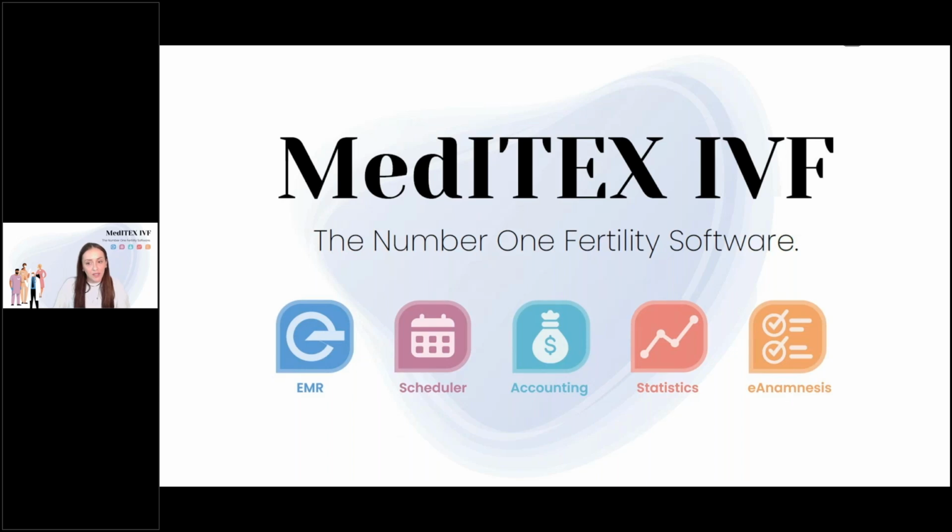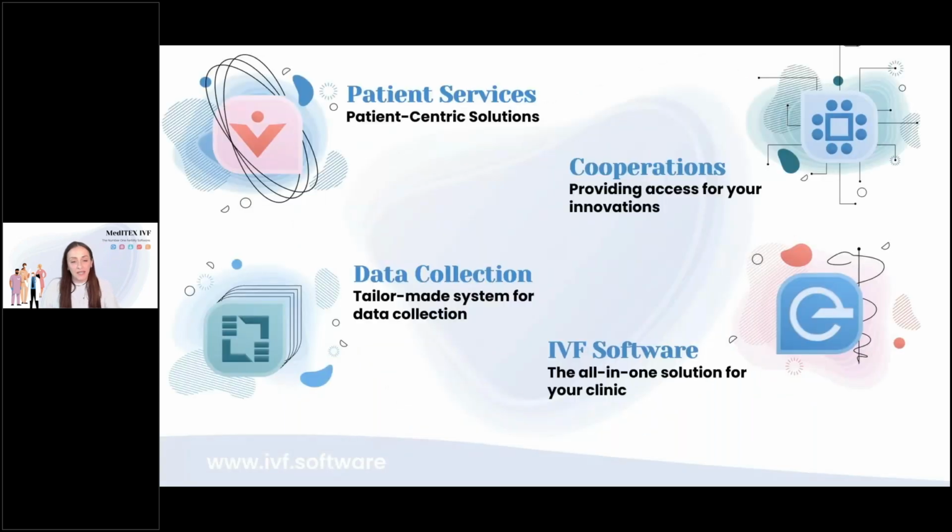Now, before I talk about Crytex, the company behind MedITEX, I'd like to talk about our portfolio first. MedITEX is known for its IVF software, but our portfolio can be separated into 4 main sections. We have the patient services, the cooperations, and the data collection. I'm going to tell you a little bit more about these things throughout the session, but today we would like to focus on the IVF software itself.